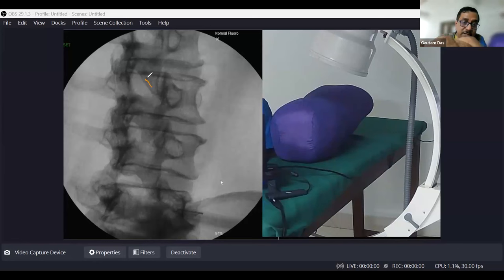As in the drawing, this is the nerve root and the dorsal root ganglion is here. So you have to go close to the dorsal root ganglion. You cannot do it by the Cambin's triangle approach. You have to go into the safe triangle approach close to the dorsal root ganglion, and only then can you do it. Understood? Those are the indications.